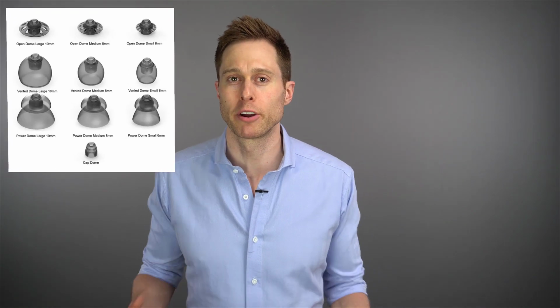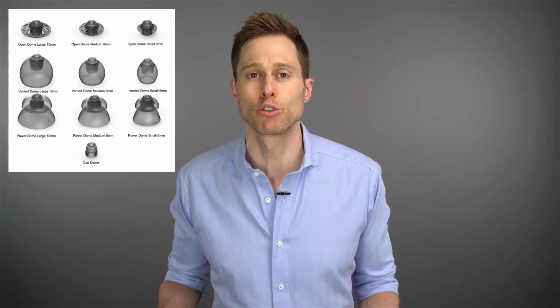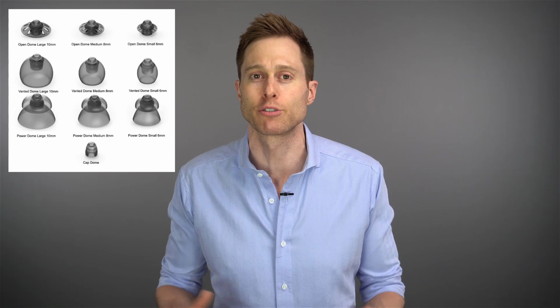Now don't get me wrong, there are a ton of generic rubber dome variations for the majority of individuals who have a traditional high-frequency sensorineural hearing loss. However, one of my biggest pet peeves is when a hearing care provider will always select a generic rubber dome instead of taking that next step to perform a custom ear mold impression or a 3D ear scan so they can order a custom ear mold to better treat a complex or more severe hearing loss.